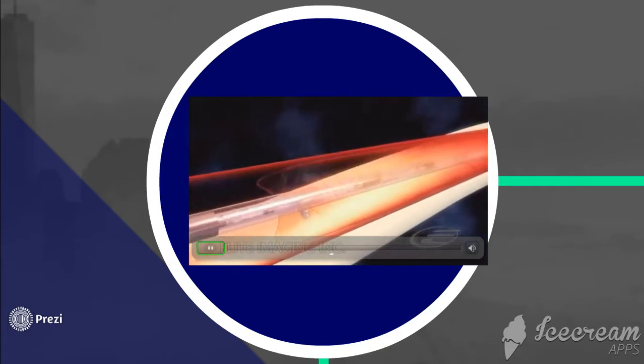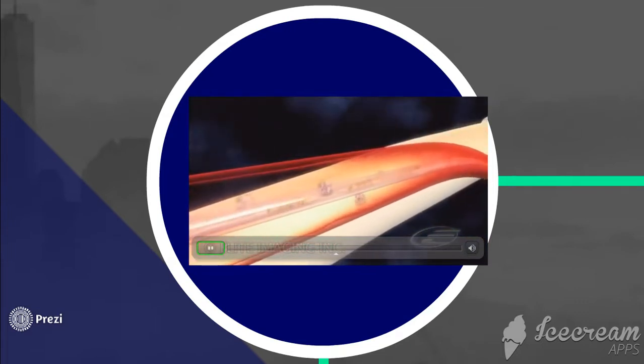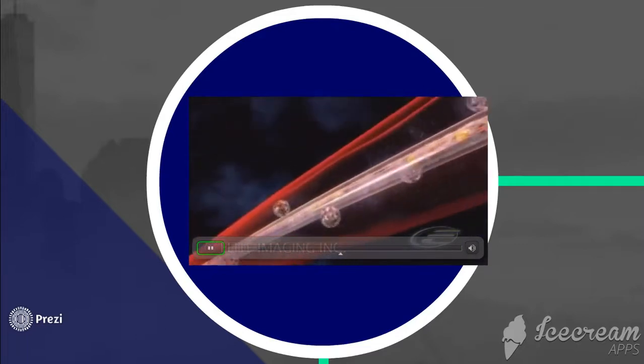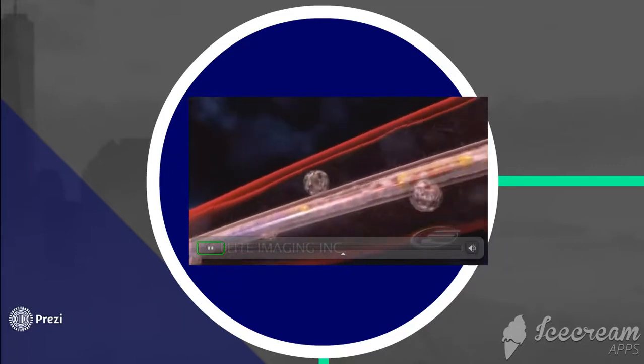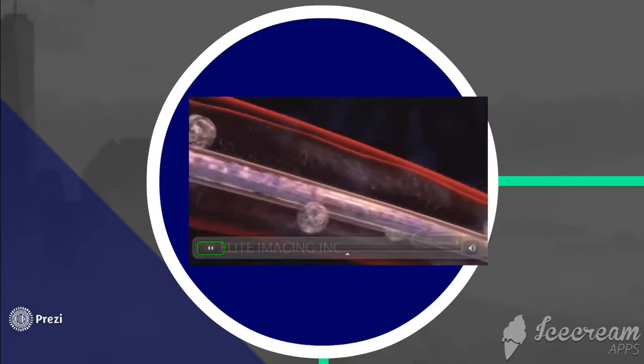The drug delivery catheter is optimized to deliver drug uniformly through the side holes along the treatment zone, while saline infusion, to cool the ultrasound core, exits from the distal tip of the catheter.